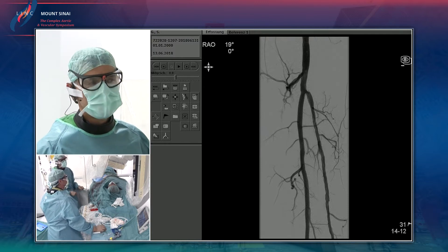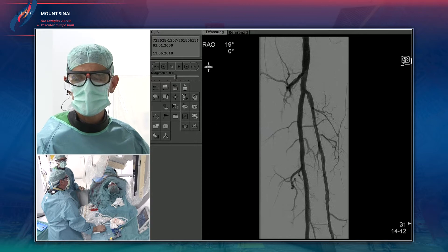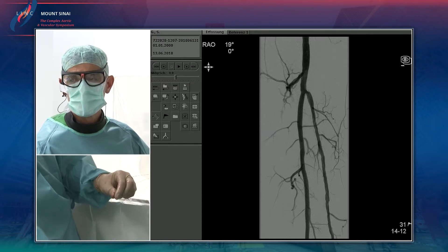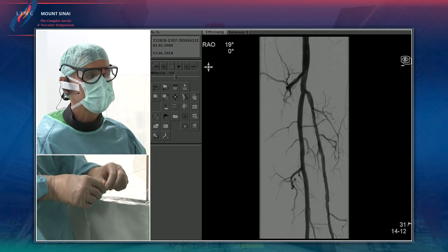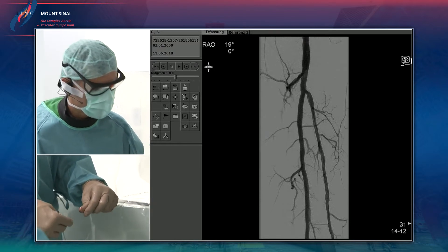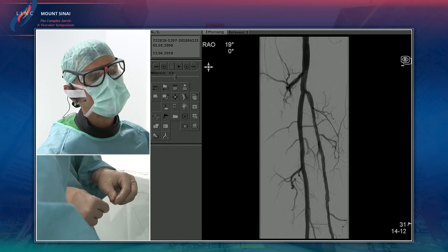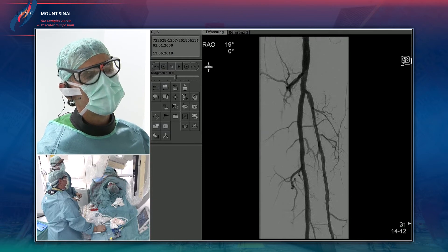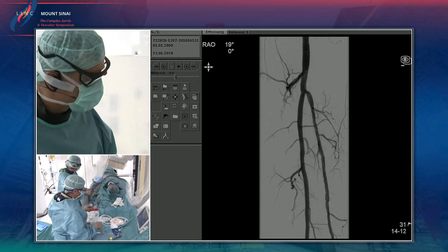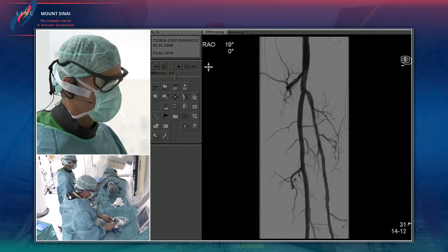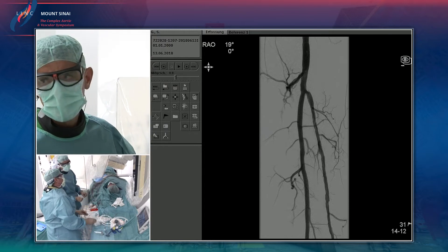A panelist asks about a bioabsorbable scaffold. The response: it is no longer available, but it has been used at the tibiopopliteal trunk in non-heavily calcified vessels; vessel sizing could be a problem here as the trunk looks like 4.5 mm. No branch occlusion problems were encountered in prior cases. Ultimately, to achieve full expansion at this location, some form of atherectomy — whether directional or laser — will likely be necessary.